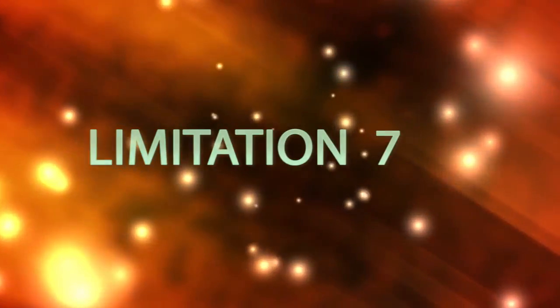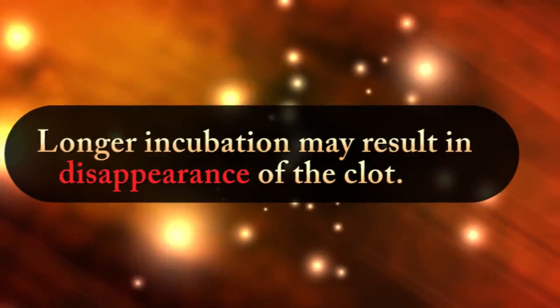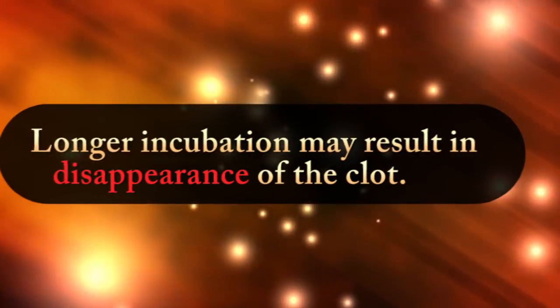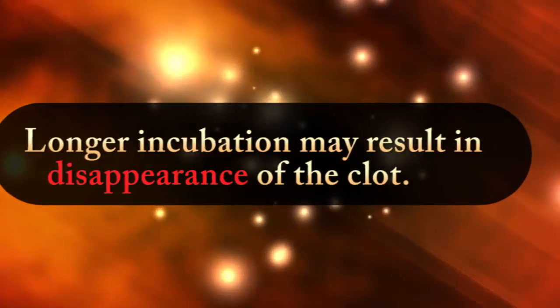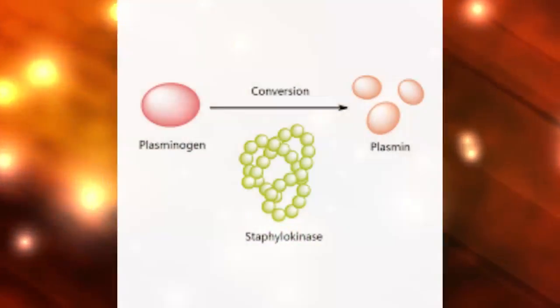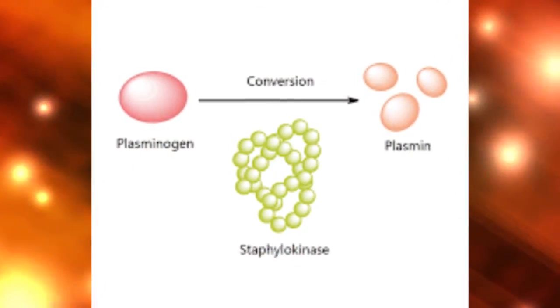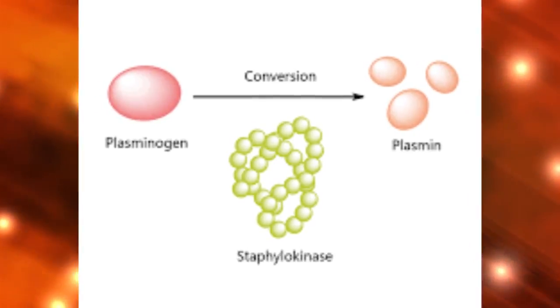Limitation Number 7: Longer incubation at 37 degrees Celsius may result in disappearance of the clot. This is due to the production of fibrinolysin by Staphylococci, which can lyse the clot.